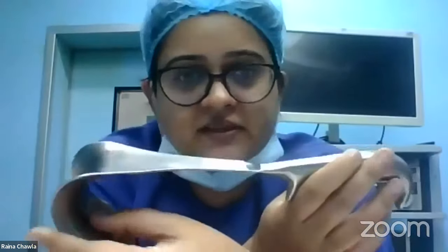It's a Doyen's abdominal wall retractor. So this is a Doyen's retractor. So a Doyen's retractor is used in cesarean section to access the lower uterine segment. Okay, so the uterus is here, and in front of the uterus lies the urinary bladder. The urinary bladder is basically what tells us where the lower uterine segment is, okay?